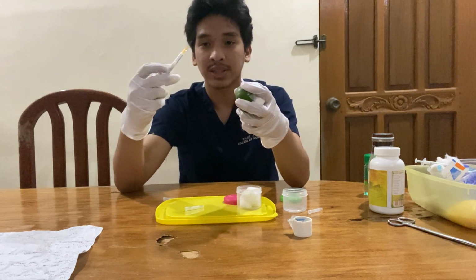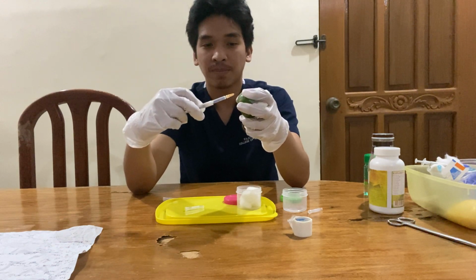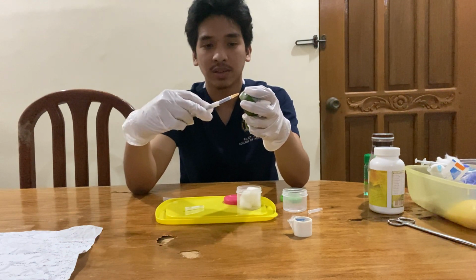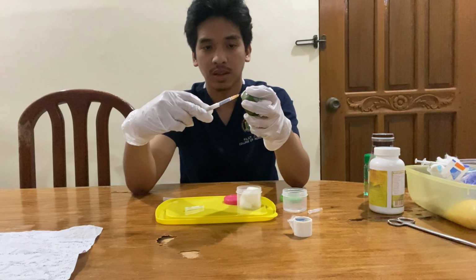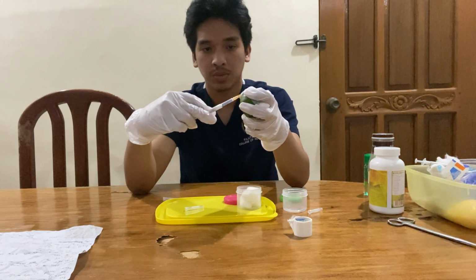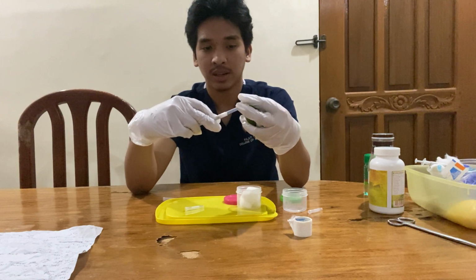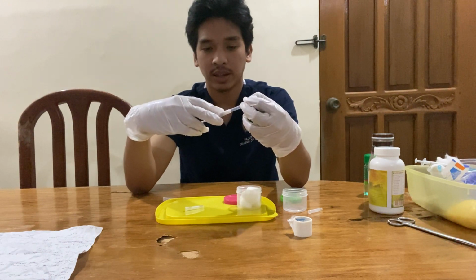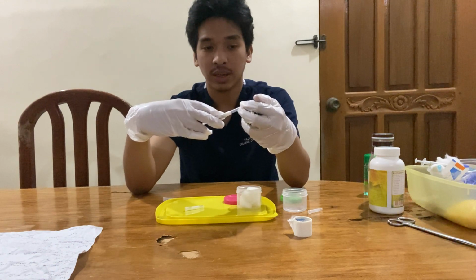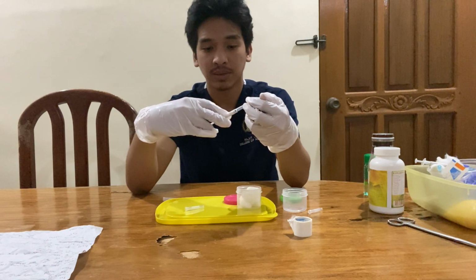So we'll inject it really parallel to the skin. Okay, so now we'll insert it. And stabilize it with your non-dominant hand and inject slowly until it forms a bleb.